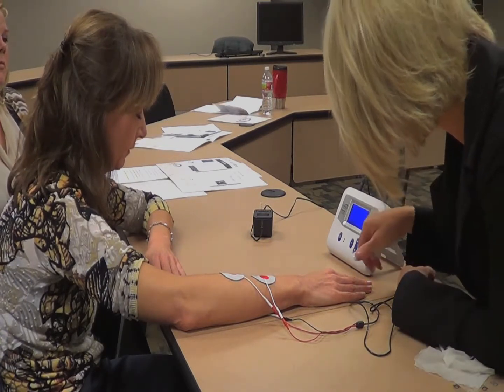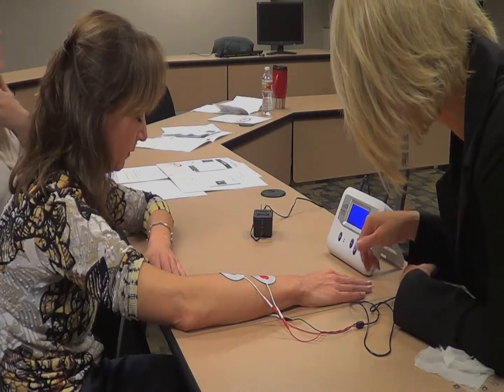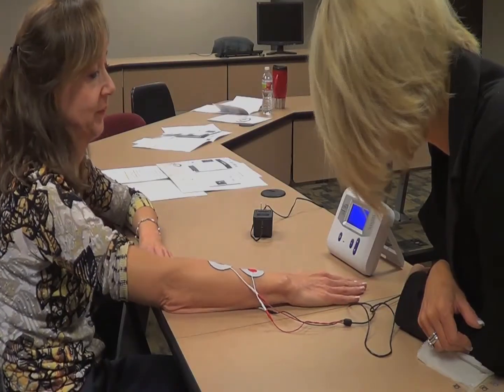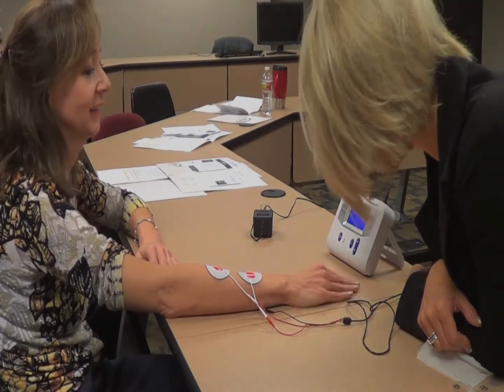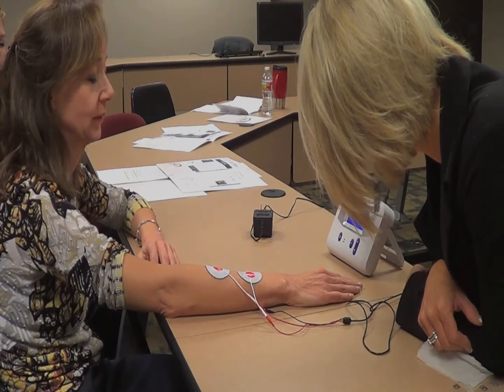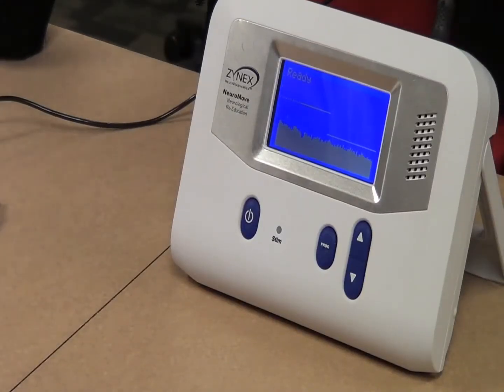So if you can see here, the threshold came way down. It's realizing that she's having a difficult time. And ready, we actually need that. Good. Is it buzzing you pretty good? Yeah. Is it hurting? No. Not at all. I think when you stimulate it, it doesn't relax as quick. Yeah. All right. Close your eyes. We're not actually getting you very calm right now.